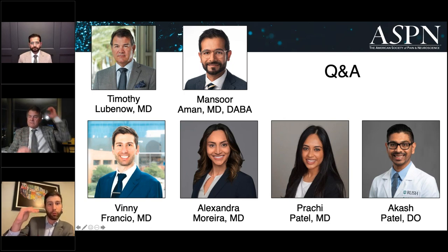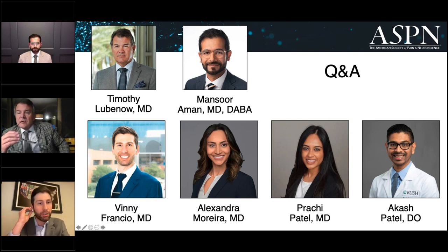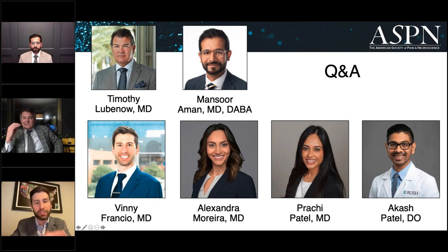So if we have an area with 4 or 5 millimeters versus 3 millimeters, and also associate that with clinical symptoms, if that matches your neurogenic claudication. Obviously I would start more conservative. I would follow the protocol that the company suggests, with the 3 bites and scoop and things like that, reassess and see how things are going, and go from there. That would be my decision at this time.